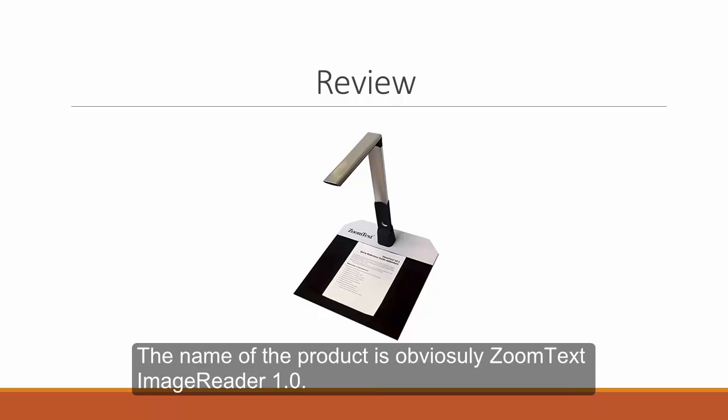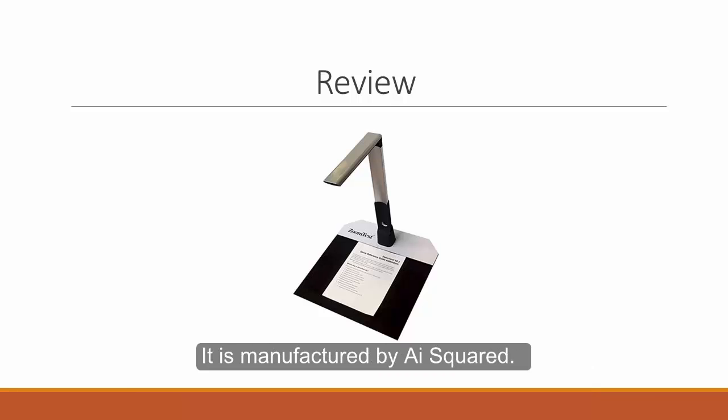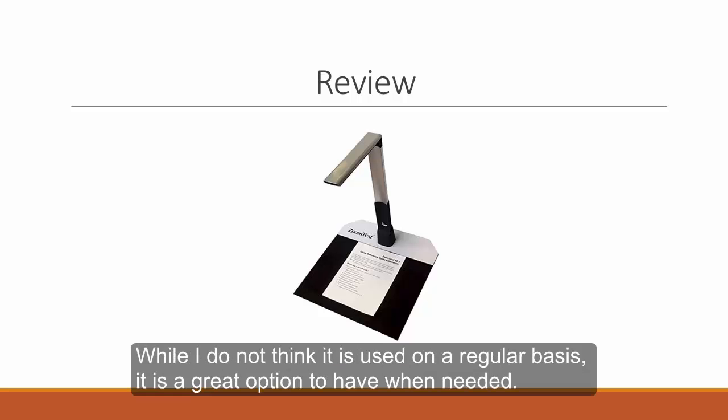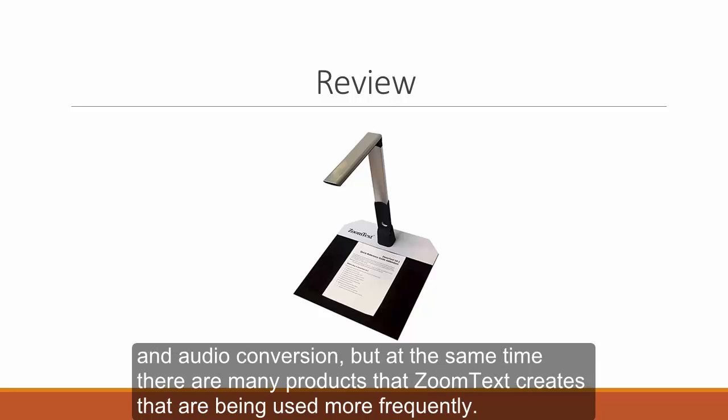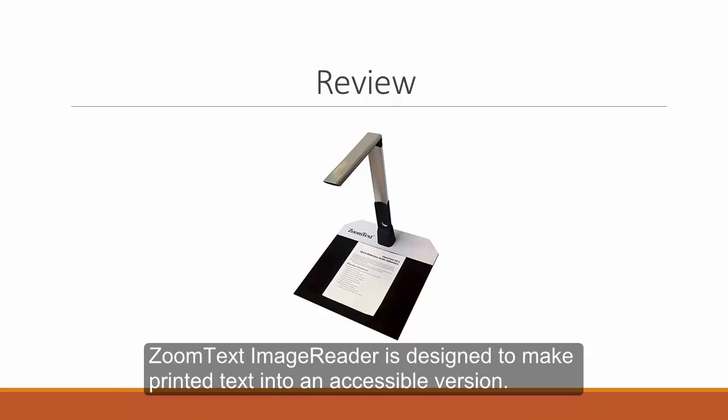The name of the product is obviously Zoom Text Image Reader 1.0. It is manufactured by AI Squared. Zoom Text Image Reader was created in 2013. While I don't think that it is used on a regular basis, it is a great option to have when needed. I think that there are a lot of other products that are used more often than ImageReader for text-to-speech and audio conversion, but at the same time, there are many products that Zoom Text creates that are being used a lot more frequently.